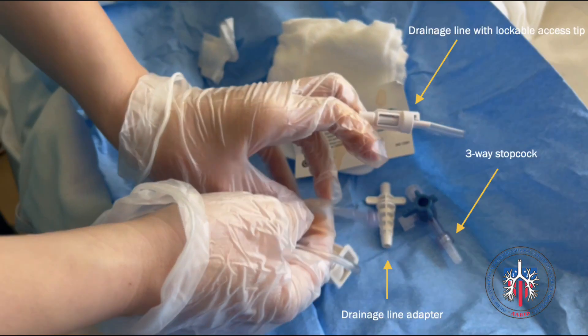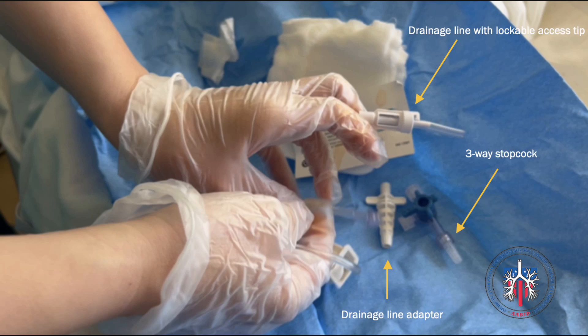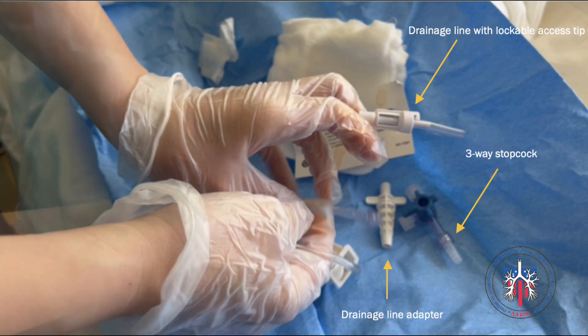To connect the tunnel-indwelling pleural catheter to the chest tube drainage system, we will need a drainage line with lockable access tip and drainage line adapter. Although not required, attaching a three-way stopcock may be useful if there is any consideration to instill thrombolytics via the pleural catheter.